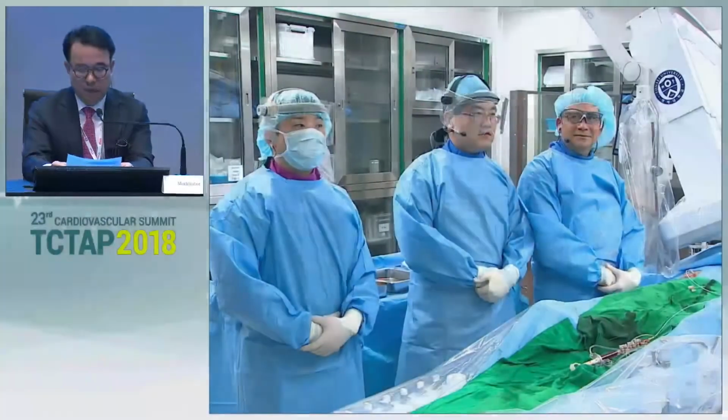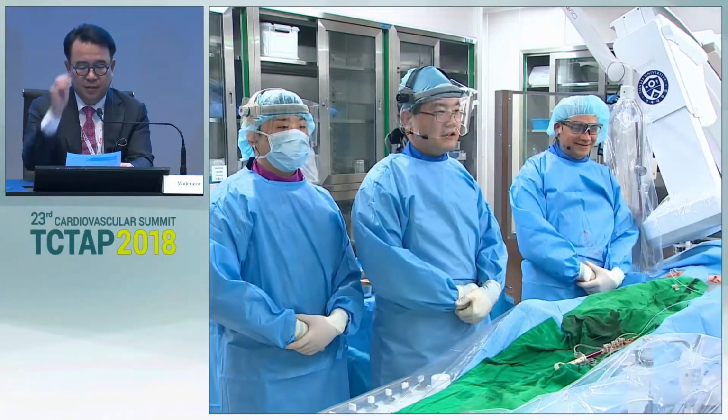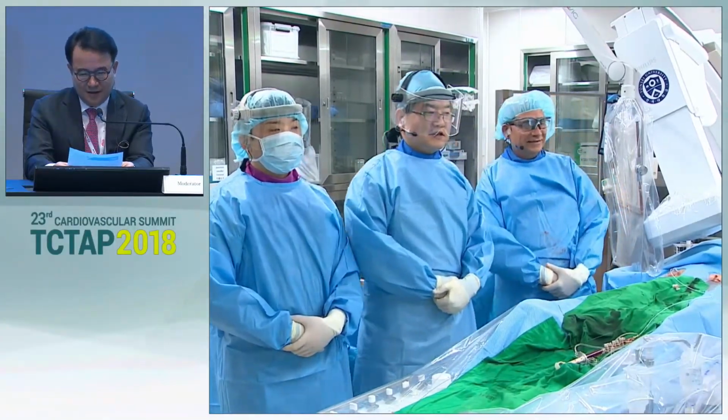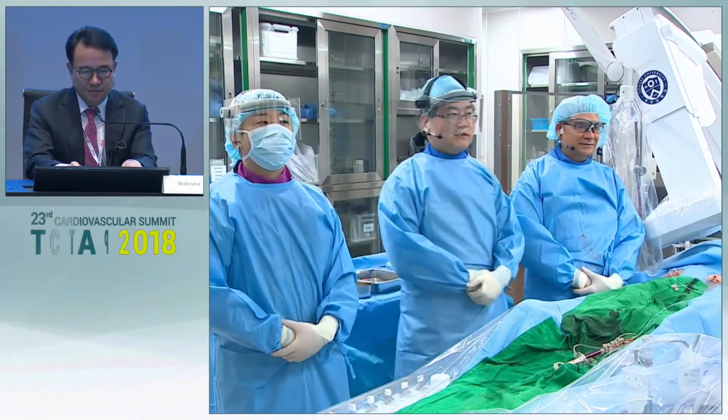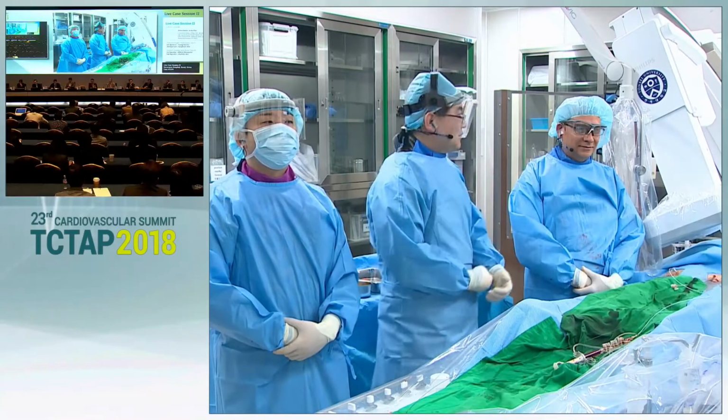Okay. So we will start case number 3. Dr. Ko? No. So we are, yeah. Dr. An. Yeah. Okay. Here. Yeah, we can see you. So please explain. Yes, good morning, team. Very good.